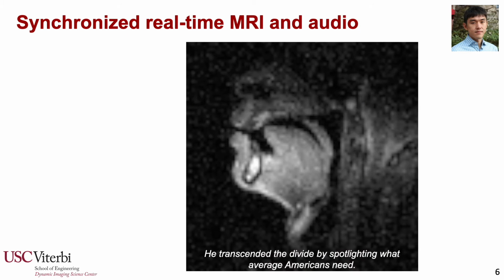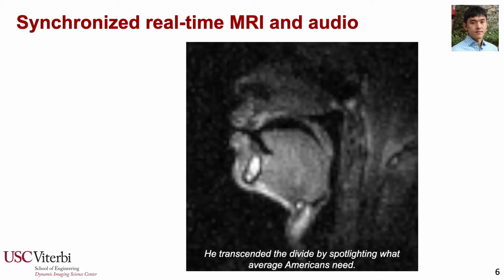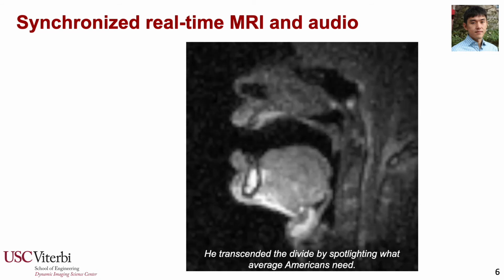So by incorporating this great real-time speech MRI, what we can do is synchronize real-time MRI images with the recorded audio. And here's just an example of the result from this system, which was acquired just a few days ago.